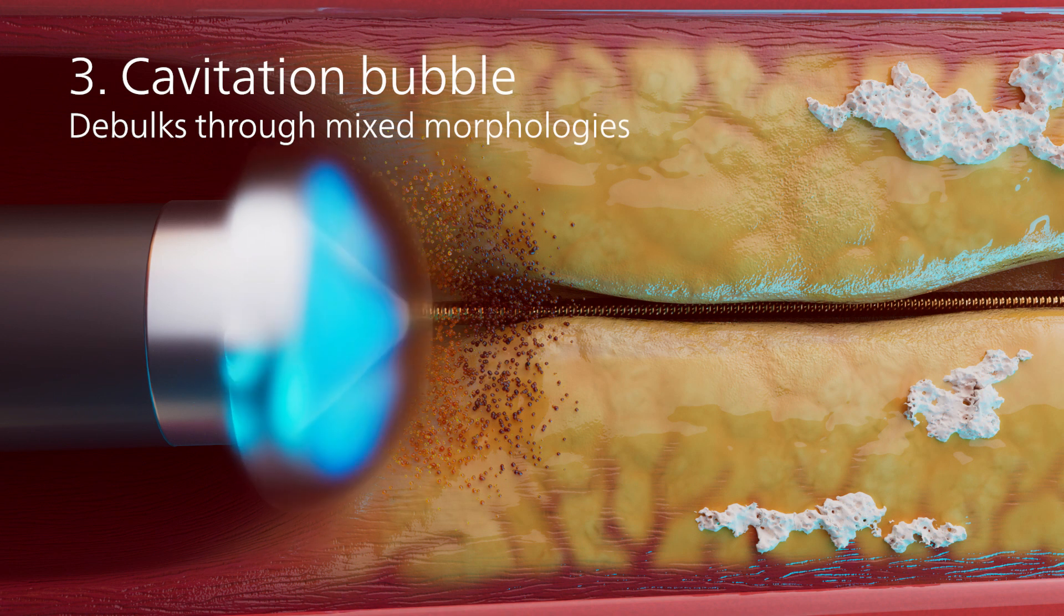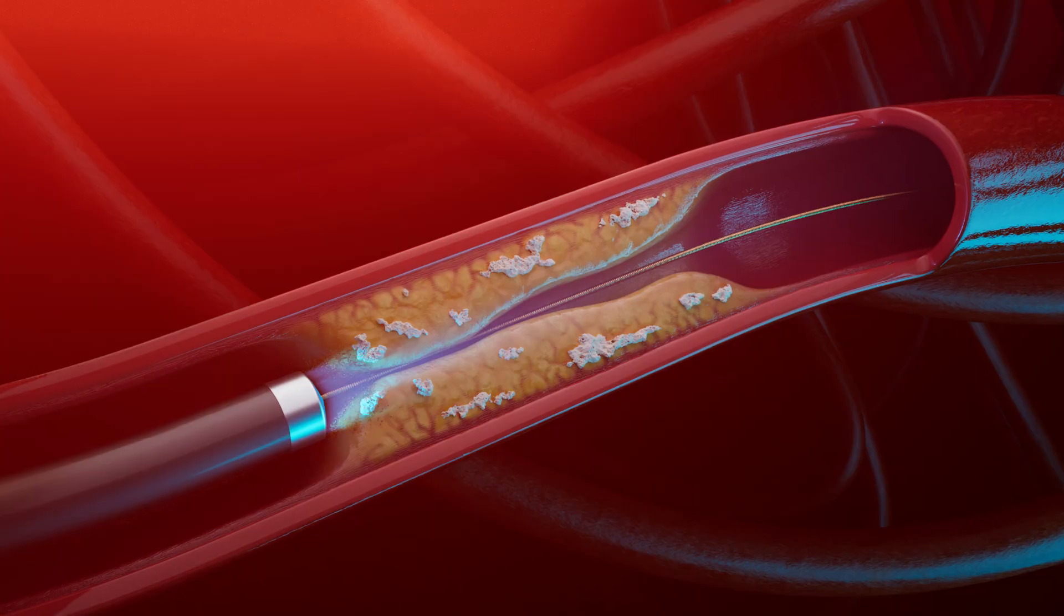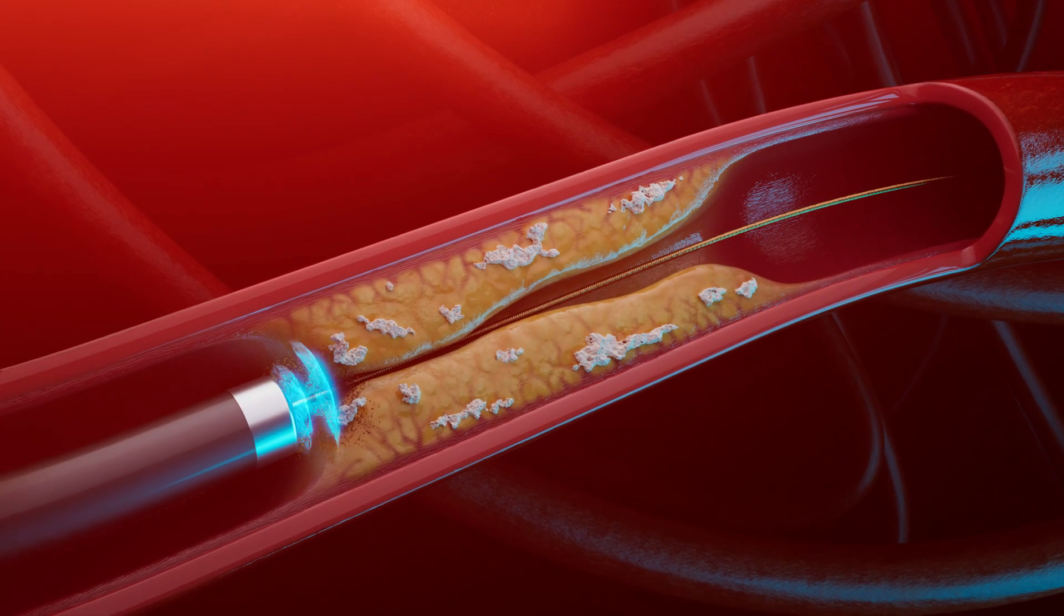In the wake of the sonic wave, a cavitation bubble is formed, expands, and collapses back in on itself, continuing to break down lesion material.